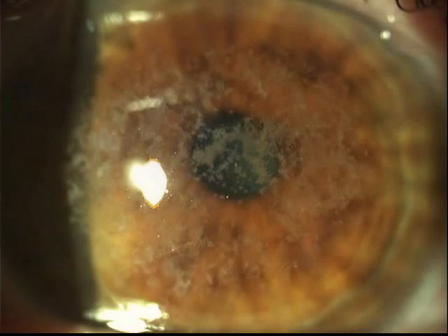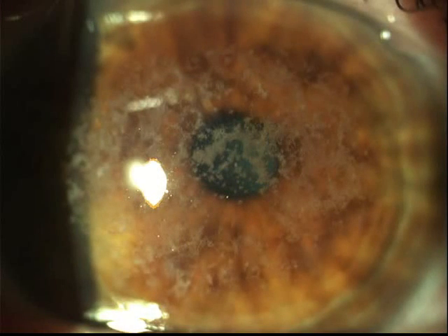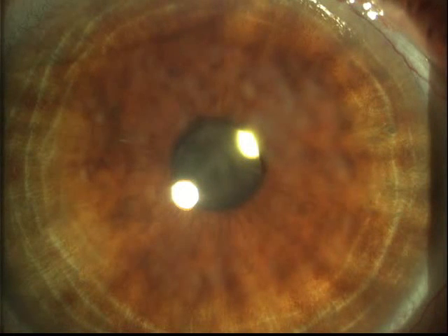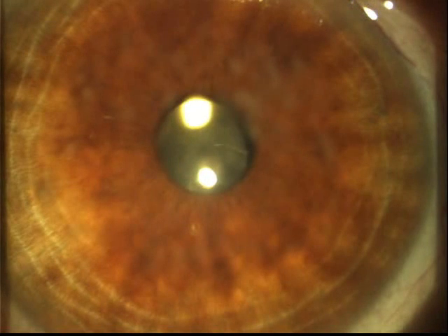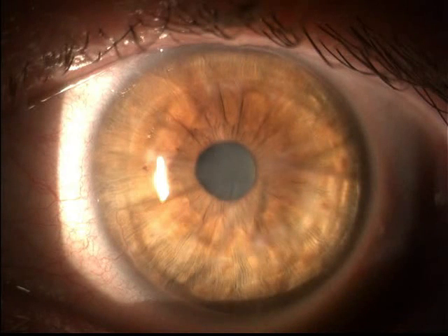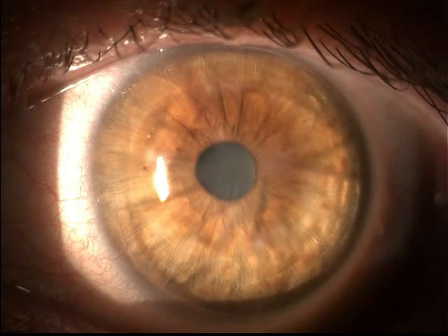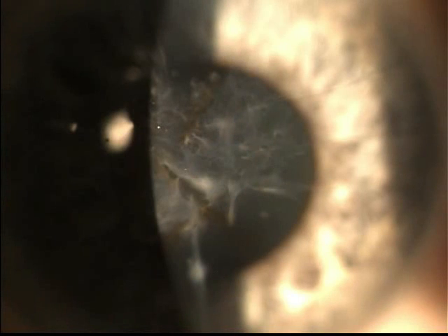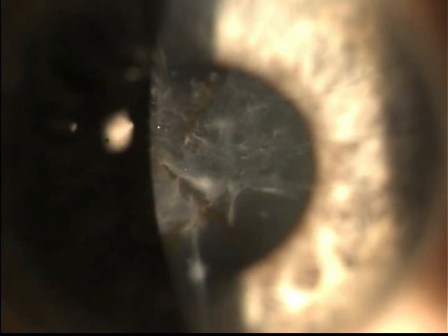In cases of corneal dystrophy, we combined lamellar keratectomy and cataract surgery at stage 1, followed by laser PRK as stage 2 to complete clarity and emmetropia. In cases of RK, this is a dense in-corneal scar that underwent straight laser to clarity and an excellent refractive outcome. In another RK case, this was an on-corneal scar that was peeled, followed by laser PRK to an excellent endpoint.